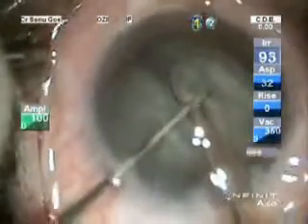The ring should be put in very delicately, and phacoemulsification is then carried out very carefully, giving least pressure on the weak zonules. After the emulsification, the lens matter is gradually aspirated out.